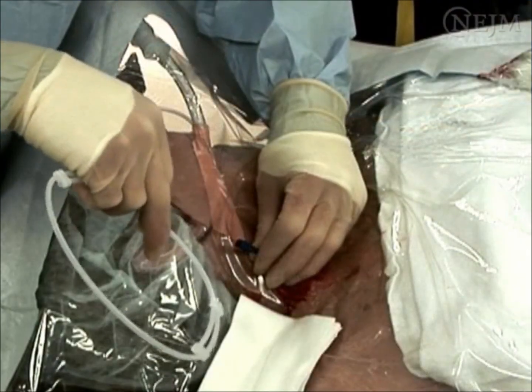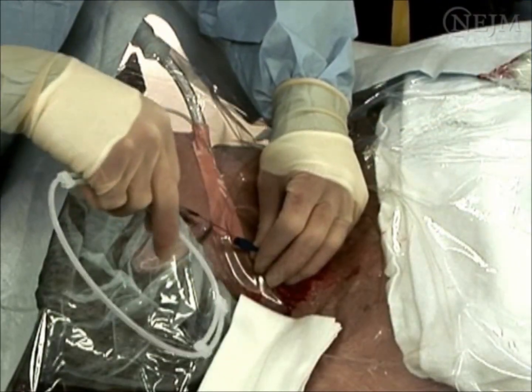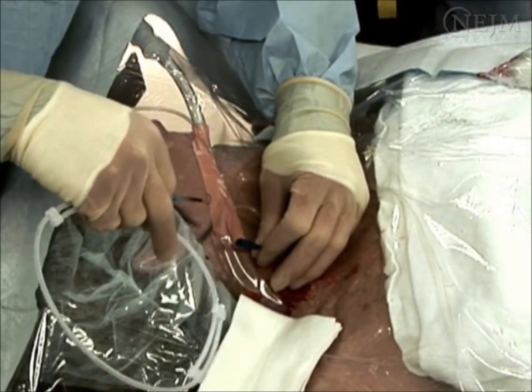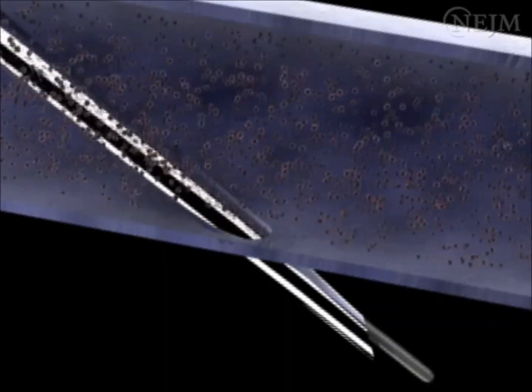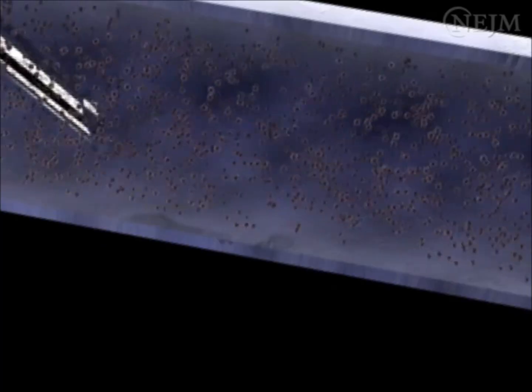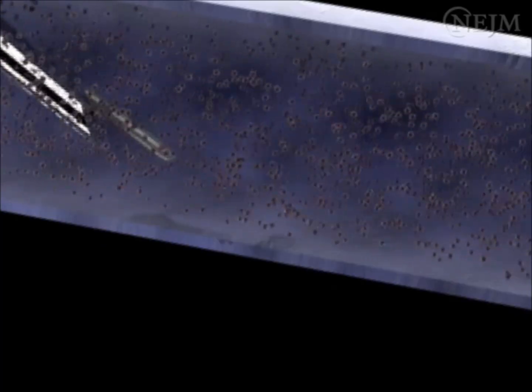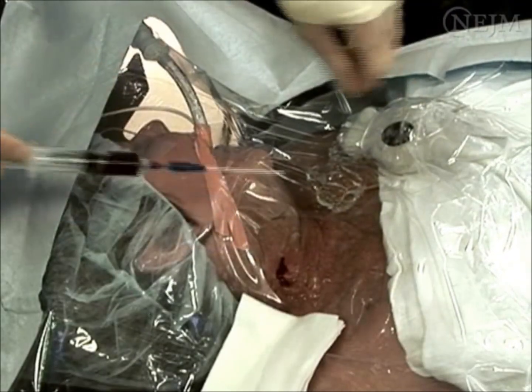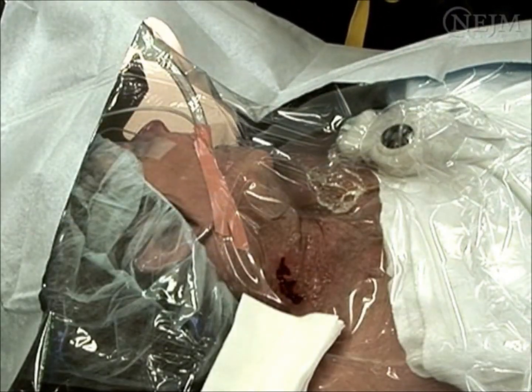If the wire will not thread through the needle, you may need to adjust the placement of the needle, since it may have inadvertently been advanced during manipulation. If so, adjust the needle and reaspirate to be sure that you are still within the vessel. If you are unable to reestablish blood flow, remove the needle and start over.